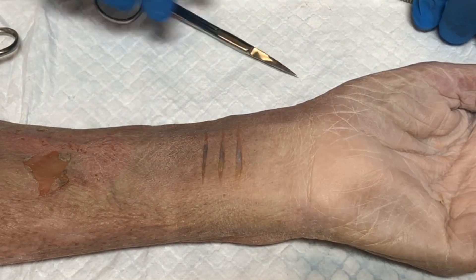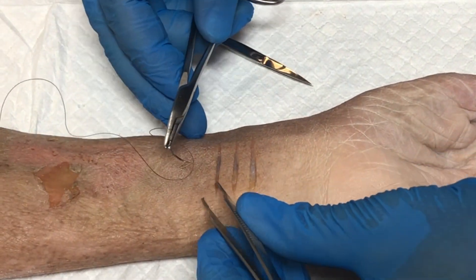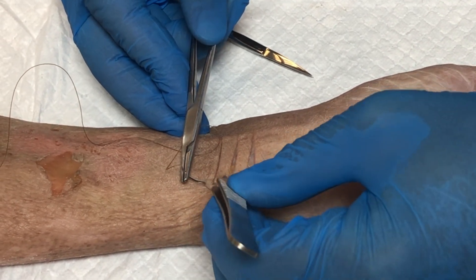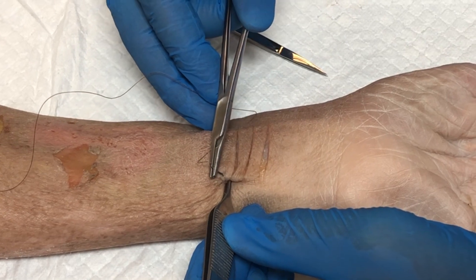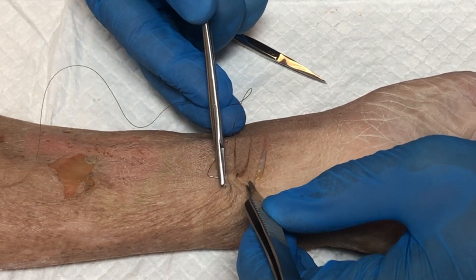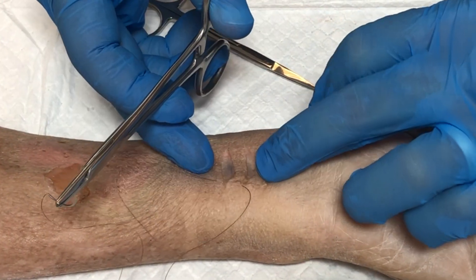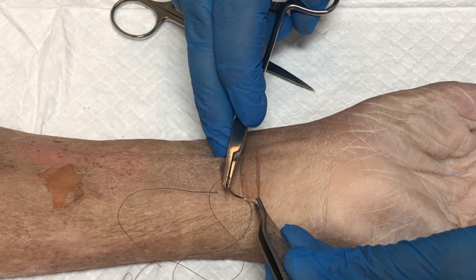We're going to do two of these to show you how this is done. We've got our needle driver loaded with suture — as always, you want to use your tissue forceps. I'm going to put my first pass right in here, and then utilizing our tissue forceps we're going to push the needle through that tissue island. With each pass through the tissue you can always pull it through and reload, especially if you're going through a significant distance. I'll be using my tissue forceps going through at the same level of tissue.